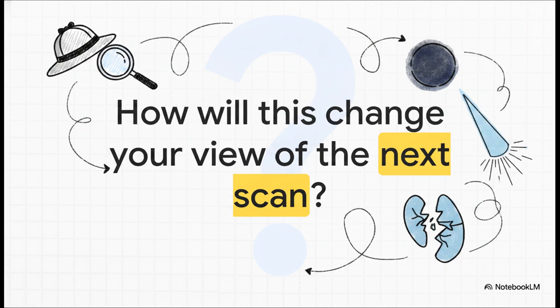The next time you see a dark shadow, a bright comet tail, or a fractured organ pop up on your screen, I really hope you don't just see a degraded image. I hope you put on your detective's hat, interrogate the physics, and let the illusion guide you right to the truth.